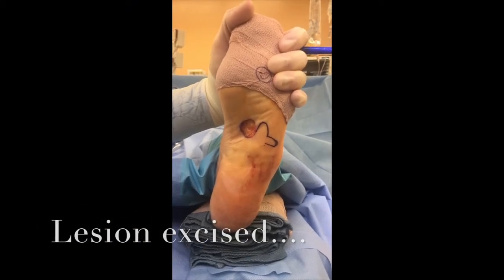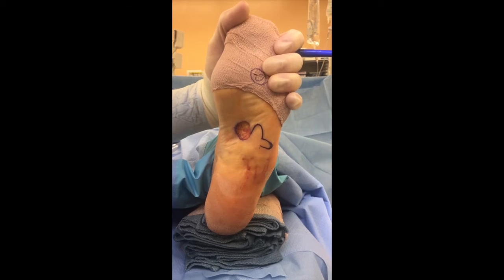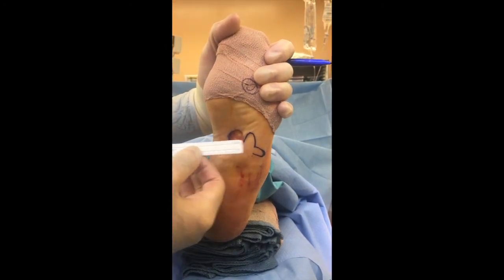This is melanoma in situ and we're going to close it with a bi-lobe flap. We've resected the lesion with about a one centimeter margin. The geometry of a bi-lobe flap is that the first flap is 75% of the width of your defect.